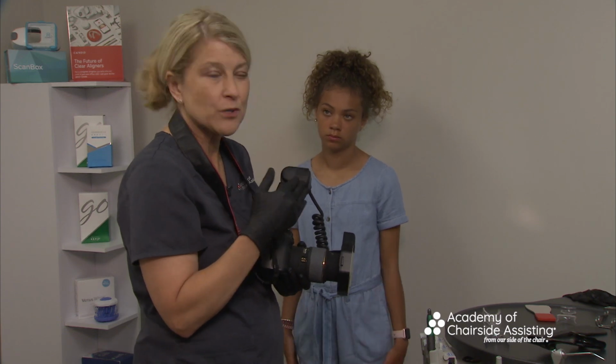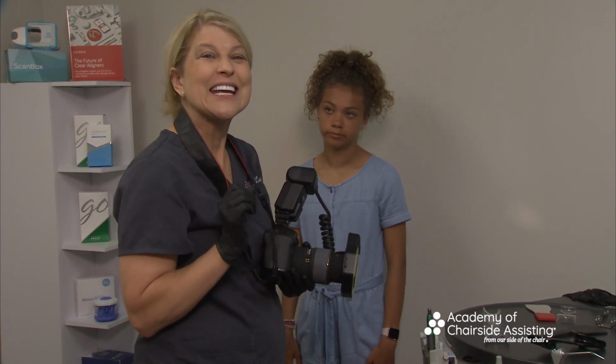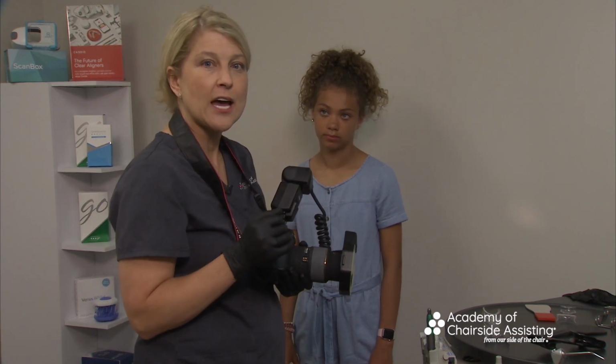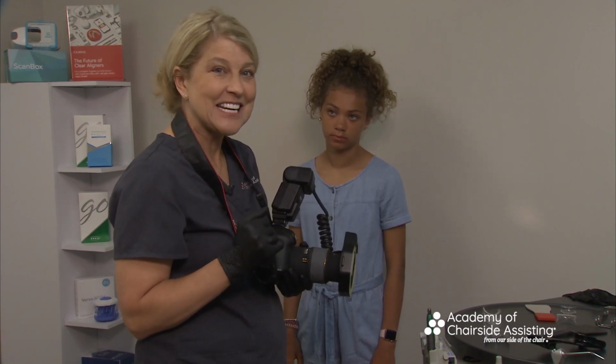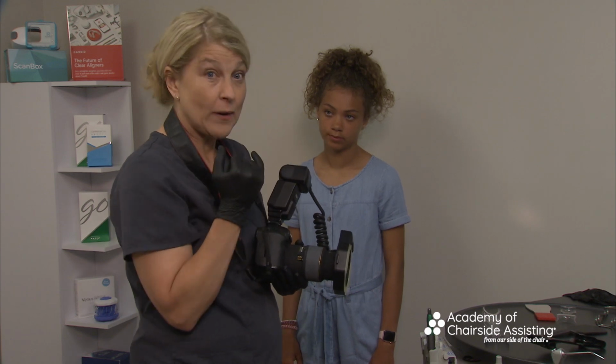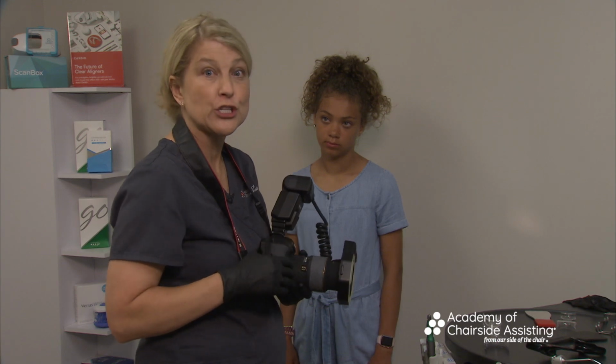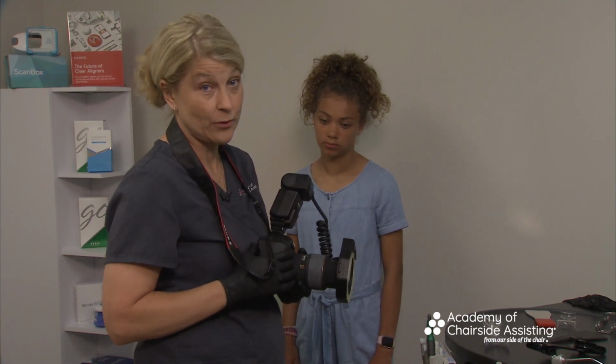So if Kylie was older, I would do what's called the E. When we say E, we'll have the patient do that, but what we're looking at is teeth from the lip all the way down to the incisal edge, because we can look and see, wow, how much tooth structure is she showing as she's talking, okay? And this will really help.